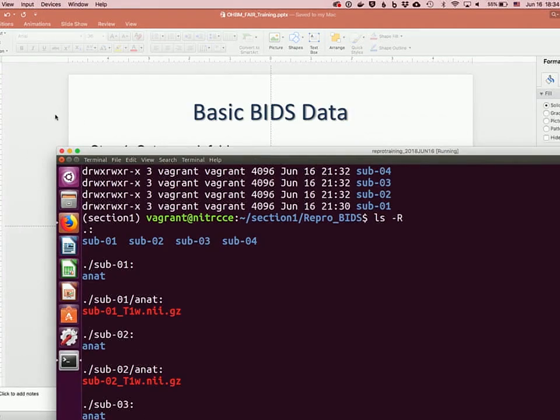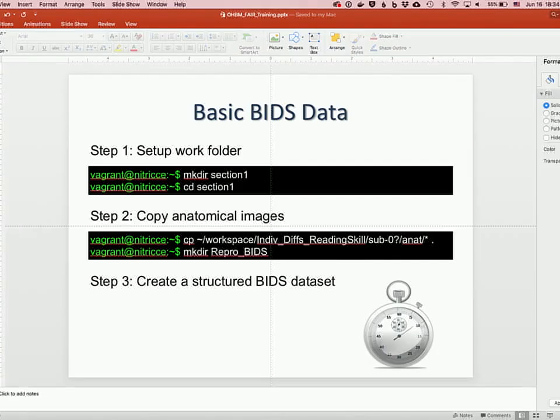The next part is still, we're going to talk a little bit about the metadata. So let's see, 39 minutes. Who still needs help in creating their directory structure? Everyone? I can move on.